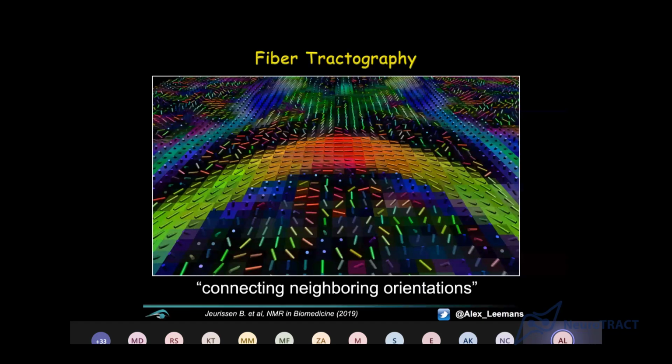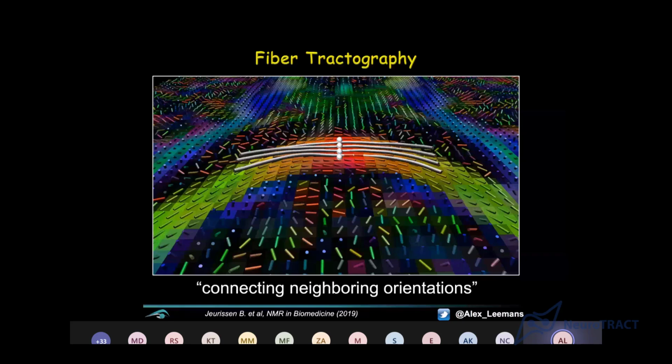We have our discrete elements of orientation in the data, and then we have starting points, seed points as we call them, from which you start connecting these little lines. So you take a little step, and then you look in 3D, right? I'm showing you this 2D-ish version, but each time you take a next step, you can reconstruct the pathway that runs through the data. Think of it like streamlines, like in a stream, like water in a river, right?